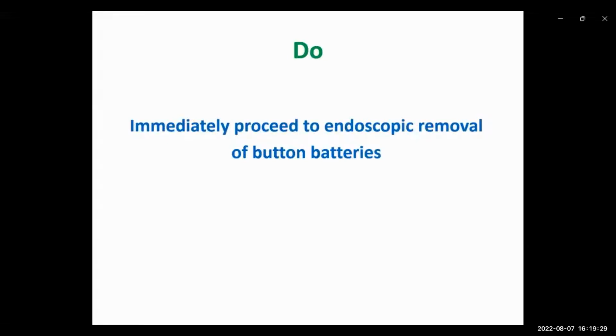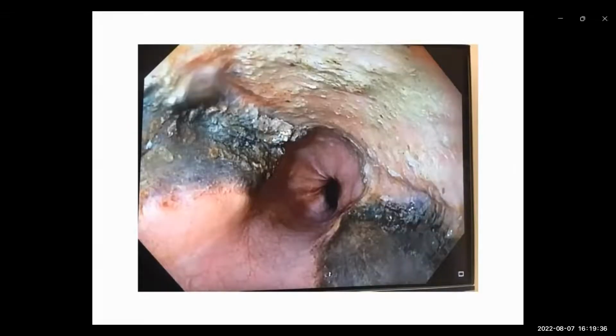Do immediately proceed to endoscopic removal of button batteries. Ingestion of cylindrical battery is rare and usually non-severe. On the other hand, the widespread use of large and high-voltage button batteries is associated with an increased number of ingestions, which can be life-threatening. Most of these cases are seen in children under 4 years.